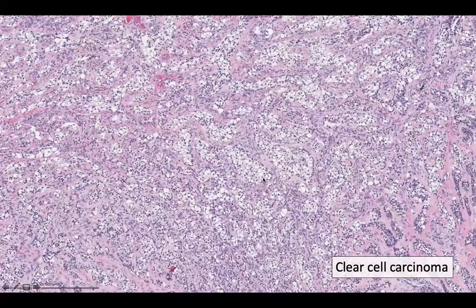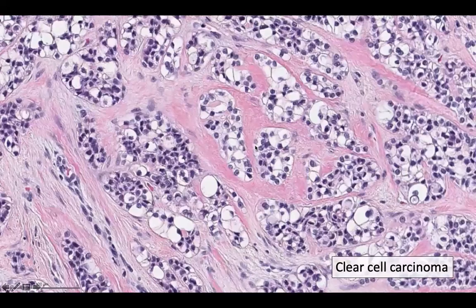And here's one that's really clear cell rich and also has that classic cellular stroma as opposed to the hyalinizing stroma. If you see this, you might even consider something like a metastatic clear cell carcinoma from the kidney. But notice it doesn't really have the same level of vascular pattern, but you still might want to exclude it. So get your PAX8, get your P40. Just another high power image of these beautiful cells with the clear cytoplasm.